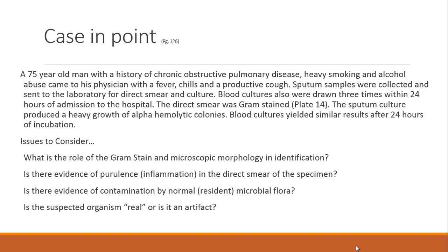All right, so the sputum culture produced heavy growth of an alpha hemolytic colony, and the blood cultures yielded similar results after 24 hours of incubation.